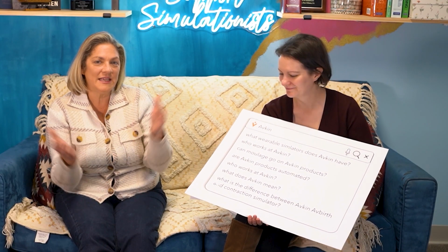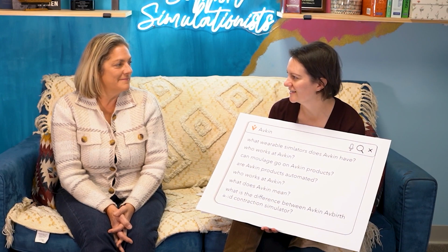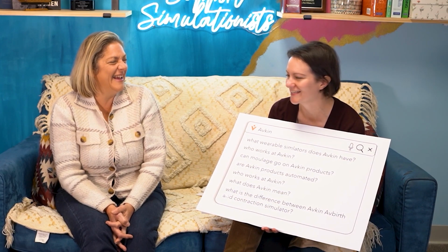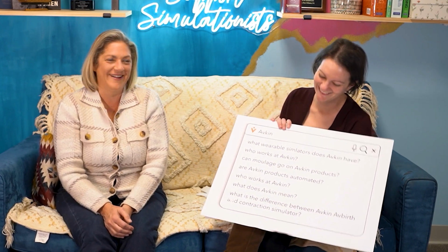So it's an inconspicuous cell phone vibration that the learners would typically not see or know was happening, but the SP is cued at the right time. If you think of contractions waxing and waning, it gives that full effect to the SP, but hopefully the learners are not seeing that at all. That was another one of our criteria as we were getting started with the company. We could try answering that question by saying, yeah, they do feel pain every time, and that's how we get those responses. I don't think we'd have a lot of people purchasing our products, for sure.